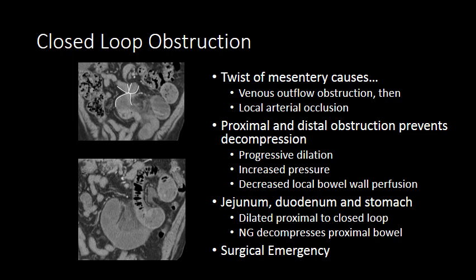In this case, we see multiple transition points coming together almost like little beaks or arrows pointing at one another. We also see a dilated C loop of bowel with substantial mesenteric edema within the distribution of that dilated C loop.